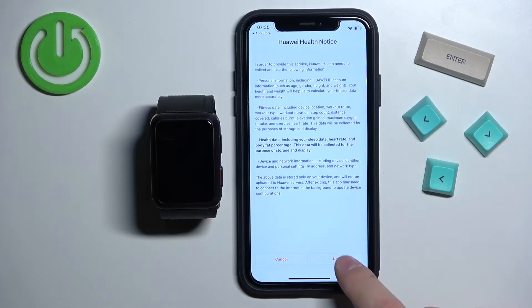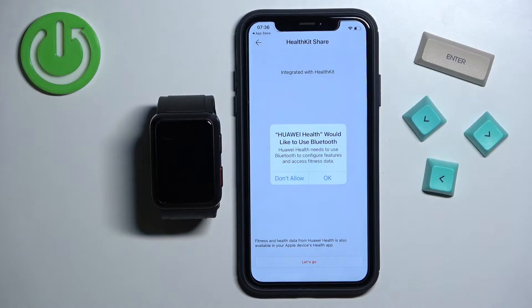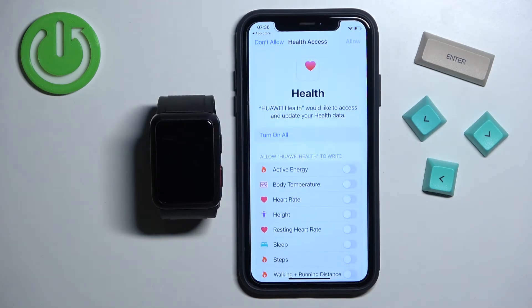Then in the app I'm going to tap on Next, and here I'm going to tap on Allow. We can allow the permission for Bluetooth — this one is required, so please tap on OK. And here tap on Let's Go, and it will open the Health Access page.